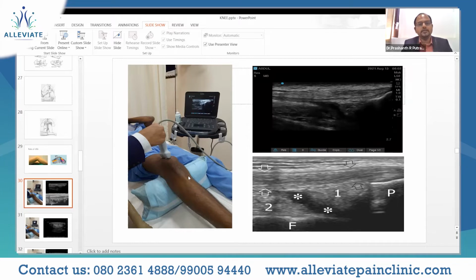So far we have discussed the anatomy. So in sonoanatomy, here you are going to use a linear probe, because the resolution is better, and the structures we need are somewhere between 1 to 2 centimeters depth. So the linear probe becomes the ideal probe for scanning the knee.